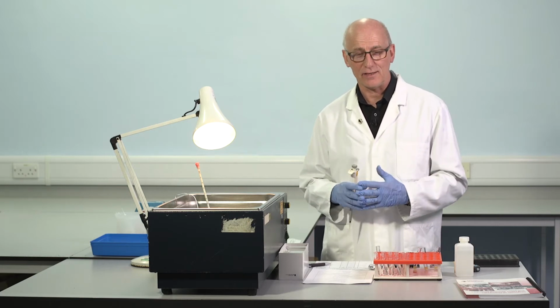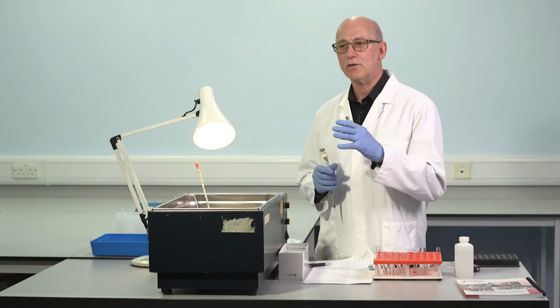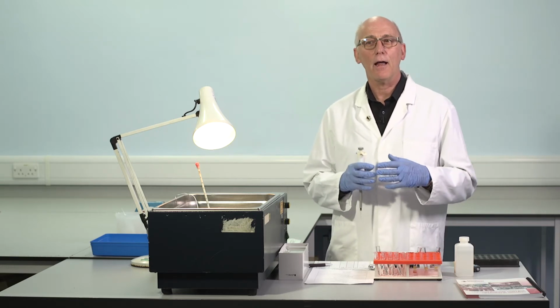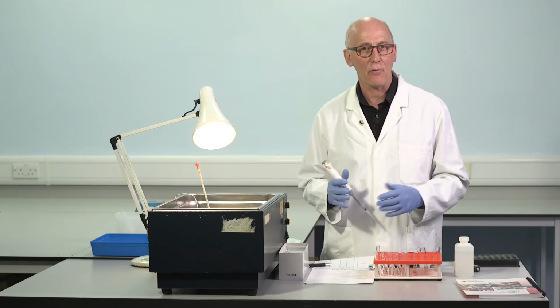patients a QC sample, an internal quality control, something that we know what is the expected level, and we use that material to confirm that the assay has been successful, it's been accurate, and that the results can be safely released for patient management purposes. Without the IQC, we really don't know that.